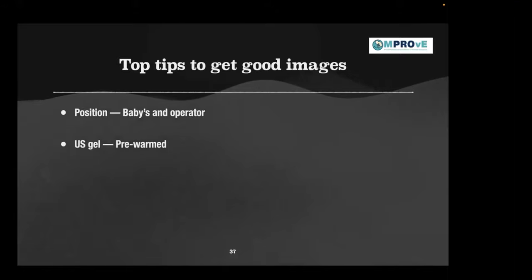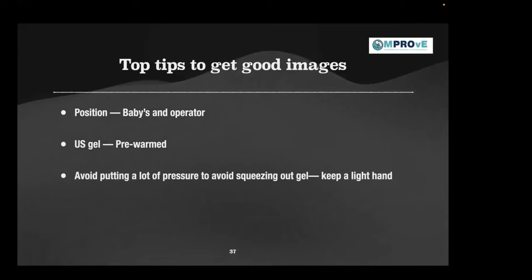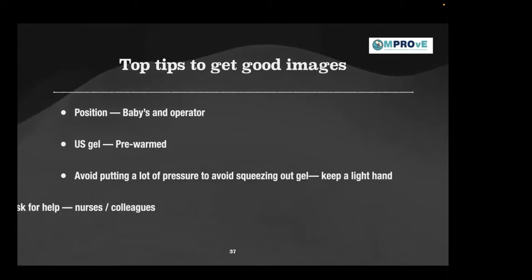Very important thing is, again, ultrasound waves hit air. So you want to take out the air pocket between your scanner and the baby, so we have to use the ultrasound gel. The second most important thing with the gel application is you don't put a lot of pressure on your probe. If you put a lot of pressure, it's going to squeeze out your gel, and that's no good. You're going to have pockets of air again. So keep a very light hand while doing a lung scan. Believe me, it will give you brilliant images if you keep a light hand.